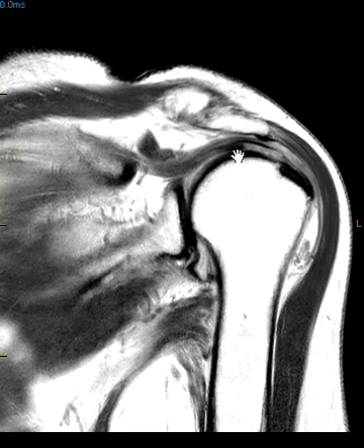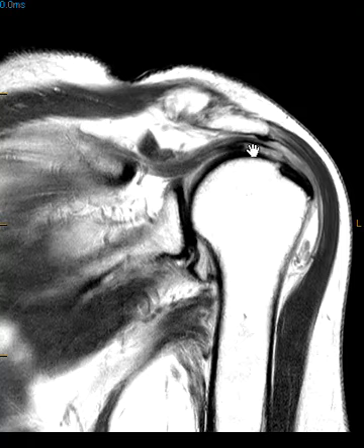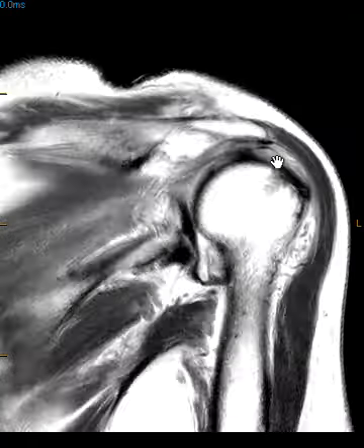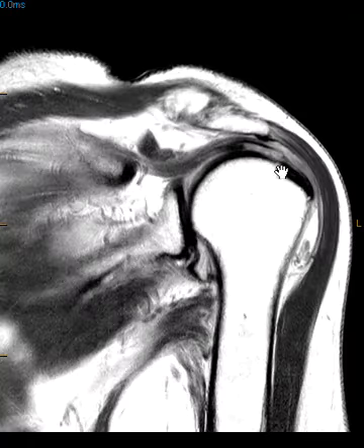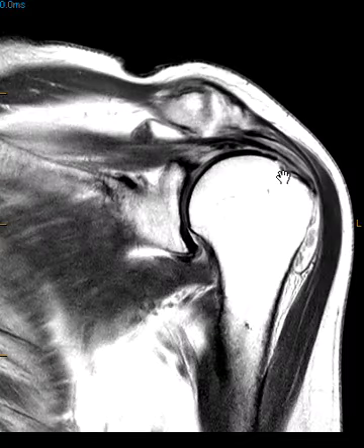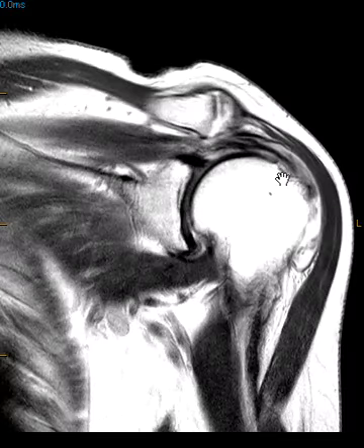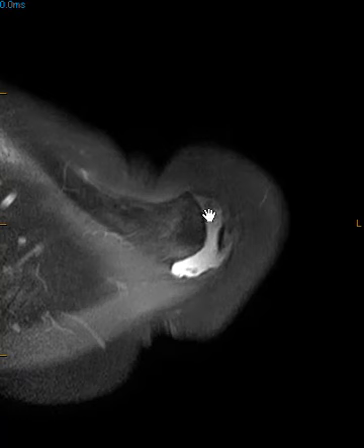You can see going down here, this little end where it comes over along the bottom — those are the undersurface fibers that should attach way over here, but they're torn and retracted way back. The bursal surface fibers along the top come over, and it looks like there is a small full thickness perforation, though that was hard to see on other images.